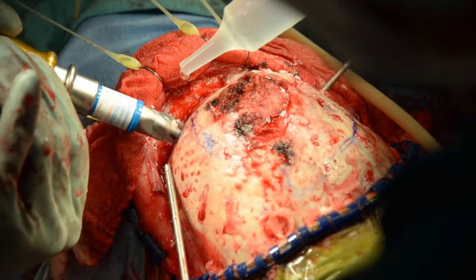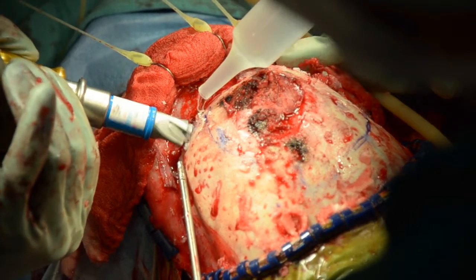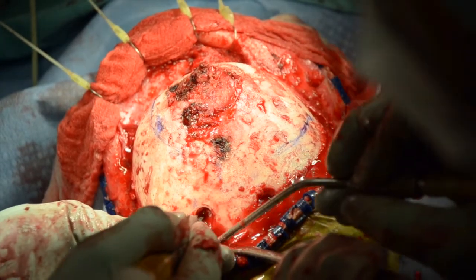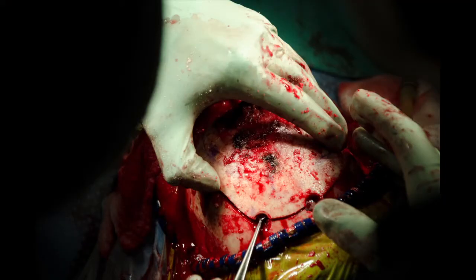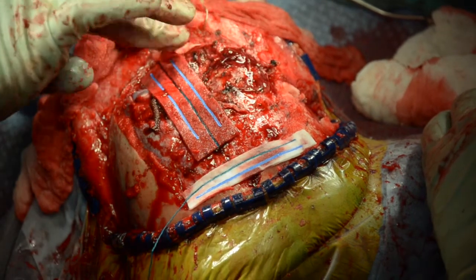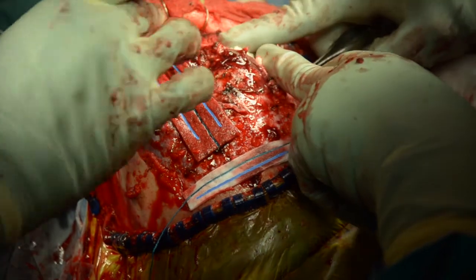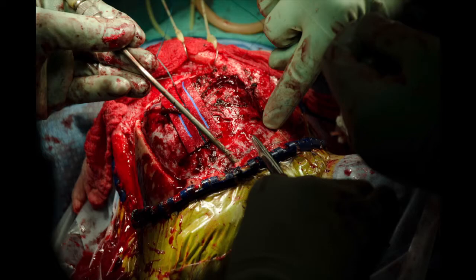Based on the specific lesion location, a planned craniotomy is outlined with two slots across the superior sagittal sinus. A high-speed drill is used to perform the craniotomy. The bone flap is carefully elevated to preserve dural integrity. Care must be taken to not injure the superior sagittal sinus. Gelfoam and cottonoids are placed over the sinus. The bone edges are waxed and meticulous hemostasis is obtained, and dural tenting sutures are placed.